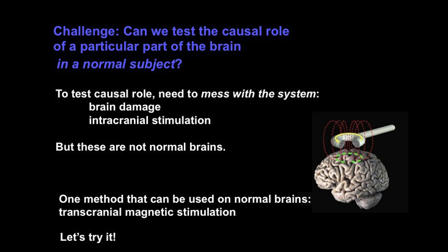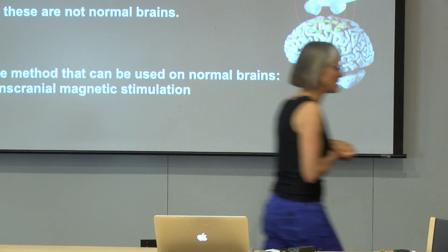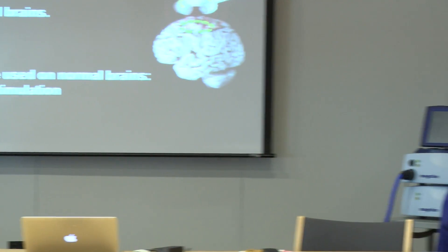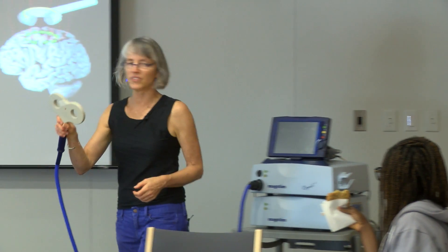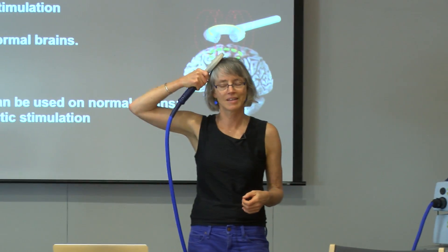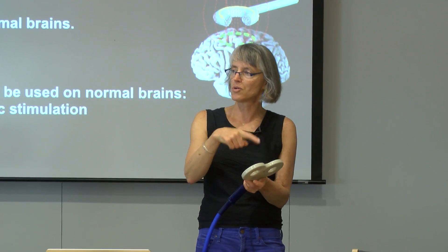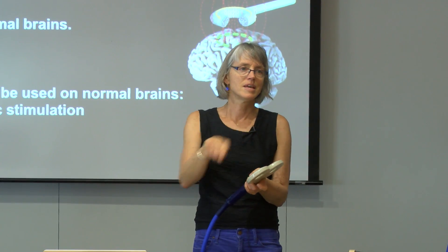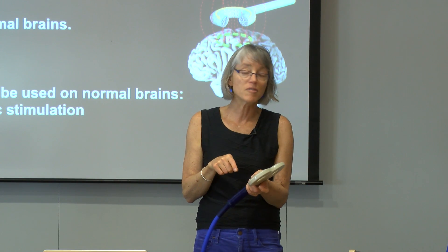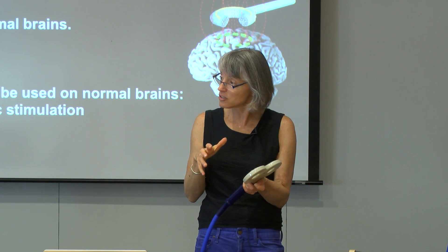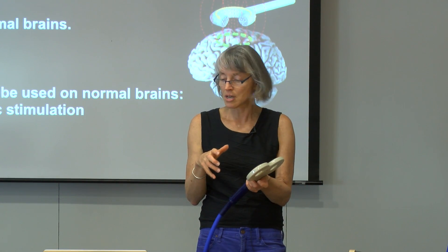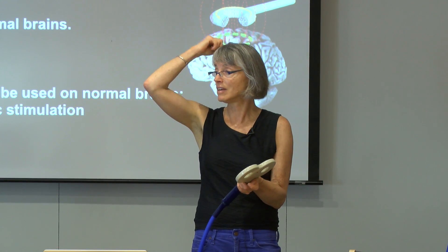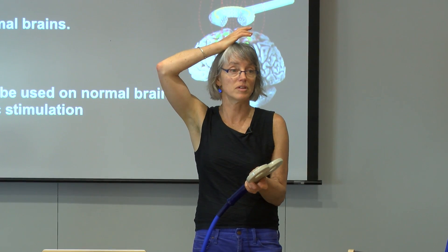In transcranial magnetic stimulation, you take a coil like this one here, and you stick it next to the head, and you run a current through the coil. The current makes a brief magnetic field change, and that brief magnetic field change affects neural activity in the region underneath the coil.